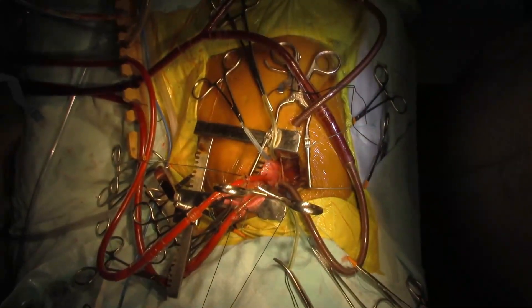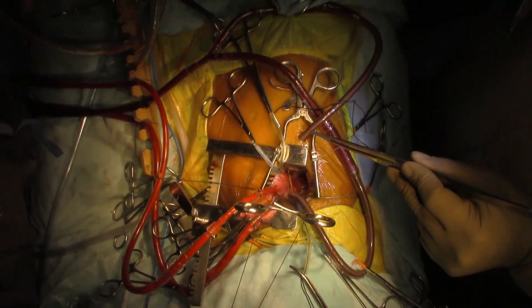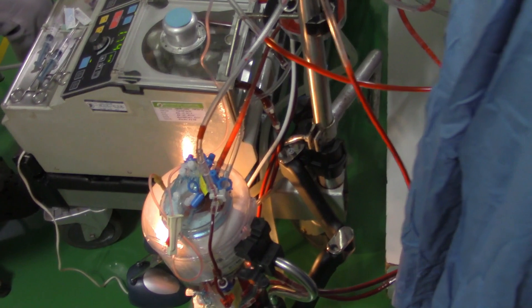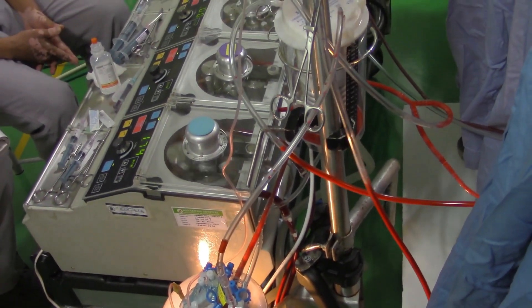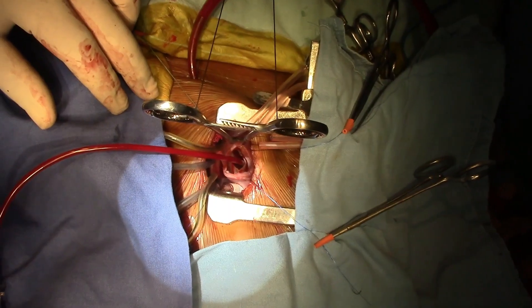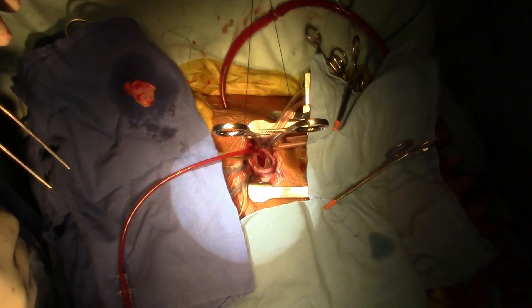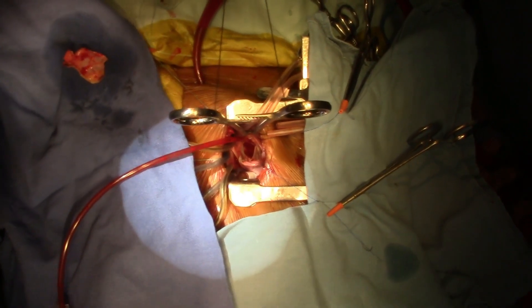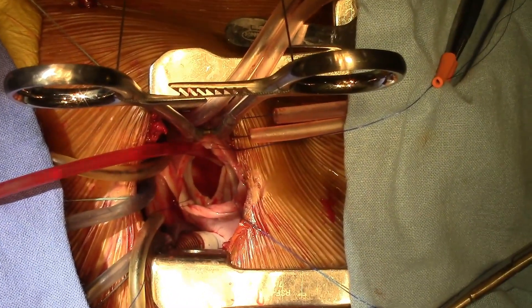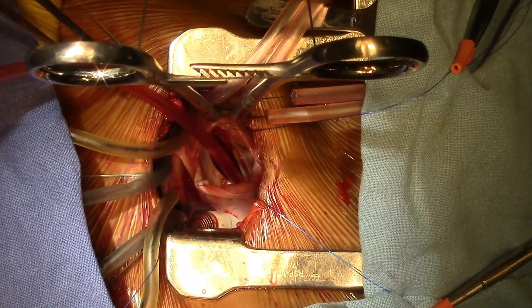VAVD has several advantages: smaller venous cannulae facilitating cannulation during minimally invasive cardiac surgery, decreased priming volume, maximized surgical usability, decreased volume of blood transfused, increased venous drainage, elimination of air blocks in the venous line, and maintaining an emptier heart in a drier operative field. Disadvantages include: blood trauma if vacuum pressure is too high, potential air draw into the venous line, reduced pump flow if negative pressure is increased (because raceway tubing won't re-expand), complication of the existing CPB circuit, and risk of serious accidents if the perfusionist is not familiar with VAVD.